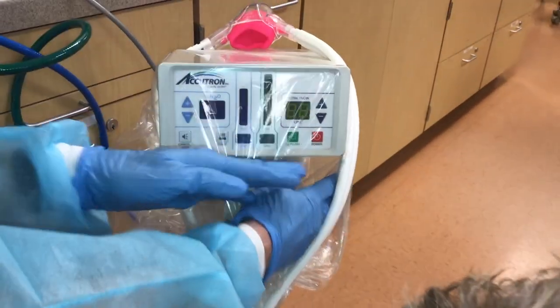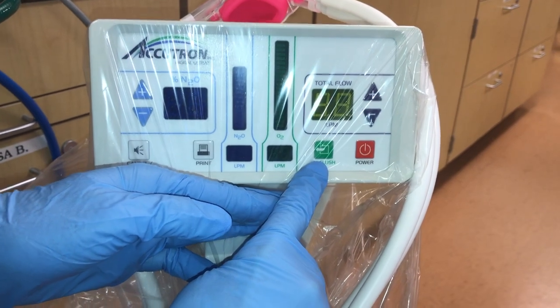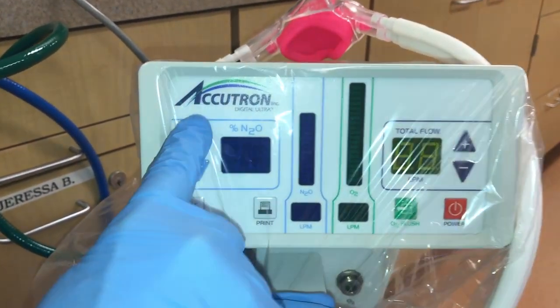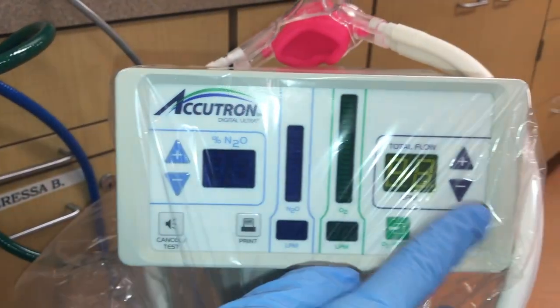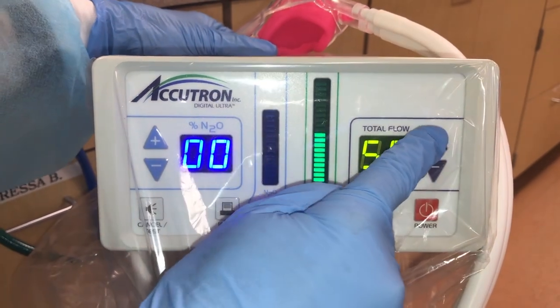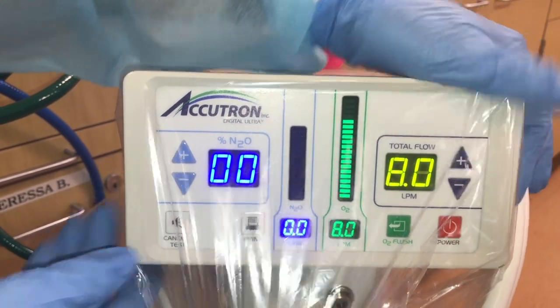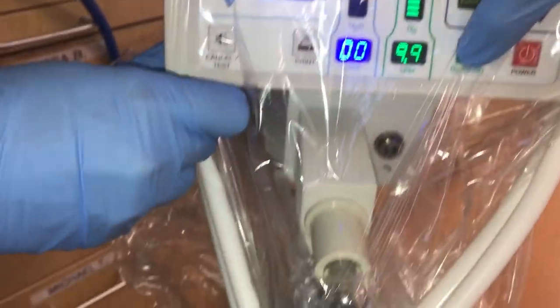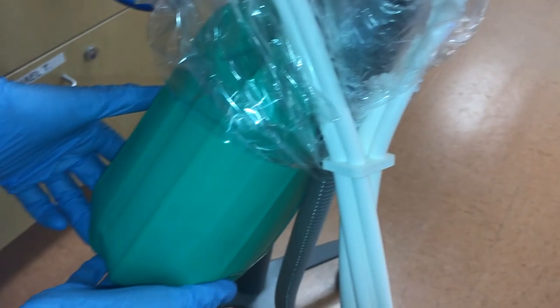The digital unit will be utilized for demonstrating an overview of the procedure. This is the power button for the digital unit, the oxygen flush button, the liters per minute of oxygen, liters per minute of nitrous oxide, and the percentage of nitrous oxide as you move the levels up and down. Once you turn the power button on, this is the total flow area. You will adjust the total flow based on the patient's respirations, and you can see the total flow of oxygen in this column. You will use the oxygen flush button to fill the reservoir bag to approximately two-thirds full.